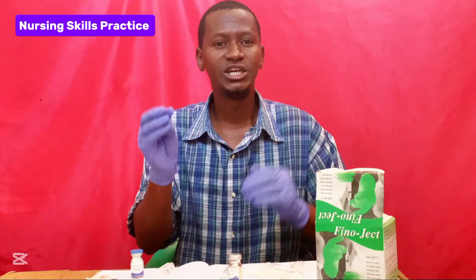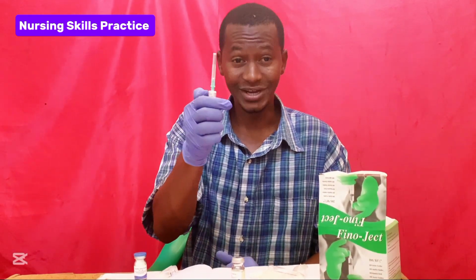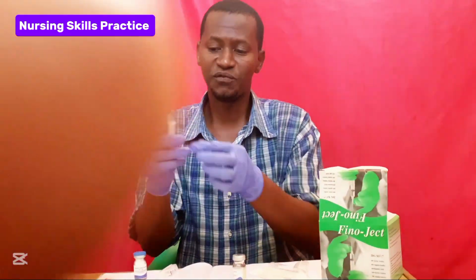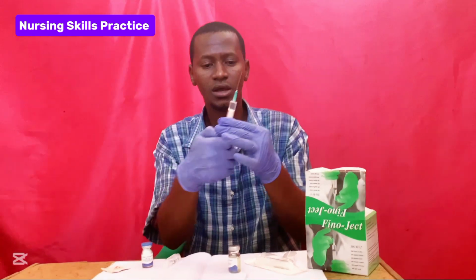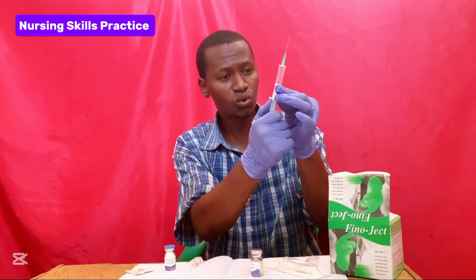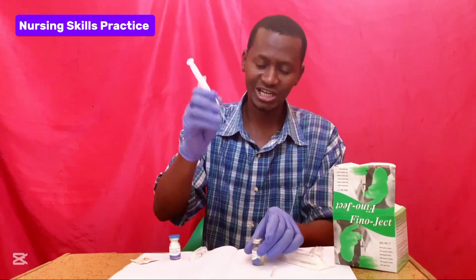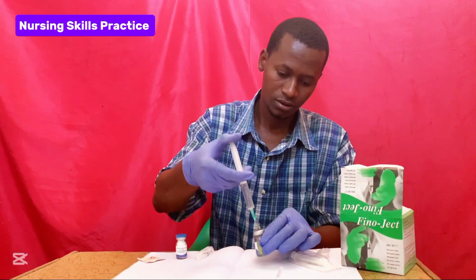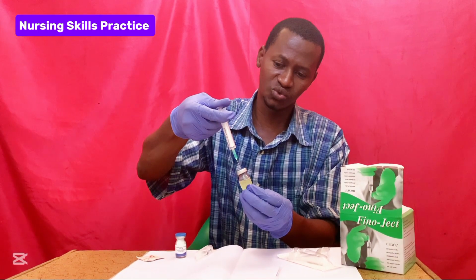When it is ready, you can now withdraw the drug from the vial. Get the syringe and remove the cap of the needle. First, make sure you put an equal amount of air into the vial before you start withdrawing the drug from the vial. You inject 4.7 millilitres of air into the vial. So make sure you put an equal amount of air into the vial.